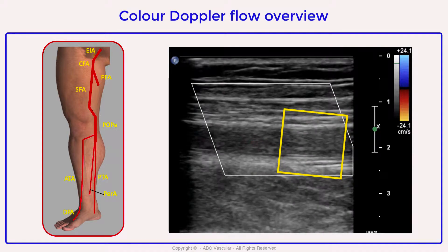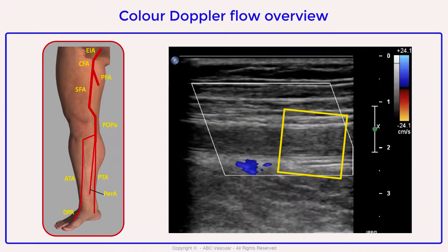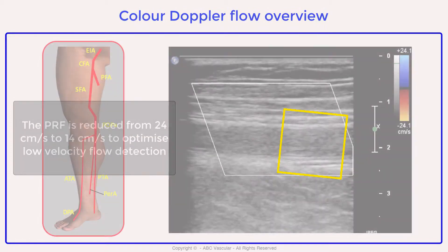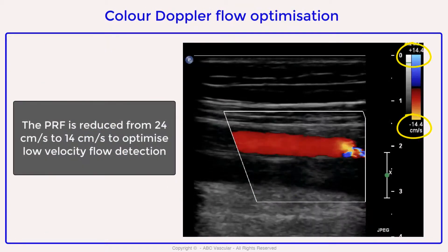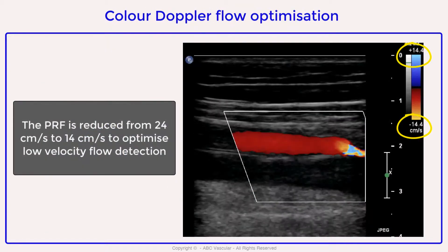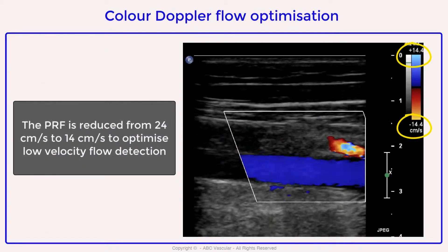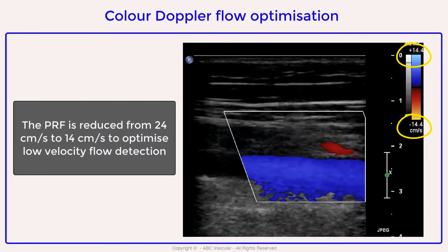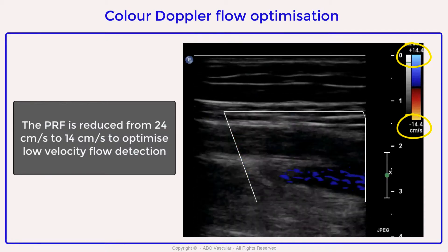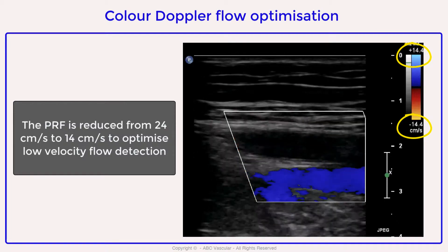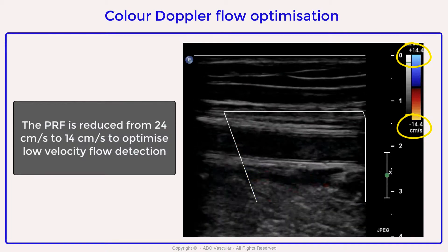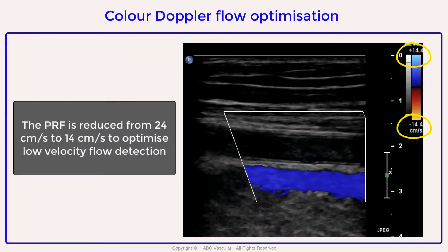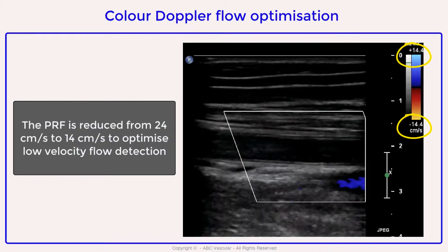We can confirm the absence of color filling by reducing the actual color scale. We bring the color scale down to 14, and we can confirm that while there is color flow filling the lumen of the femoral vein, there is no color flow filling the lumen of the superficial femoral artery.